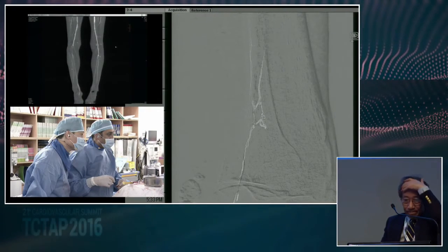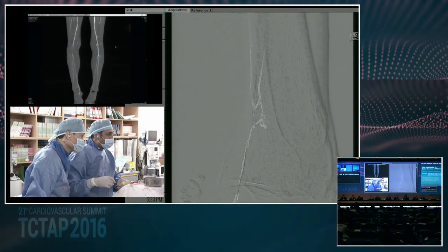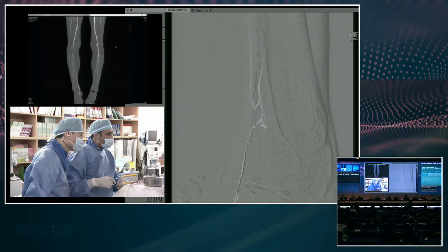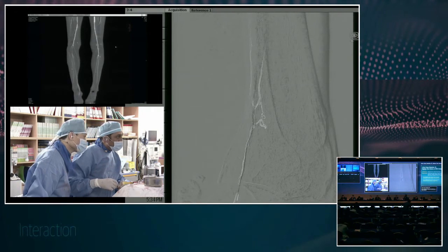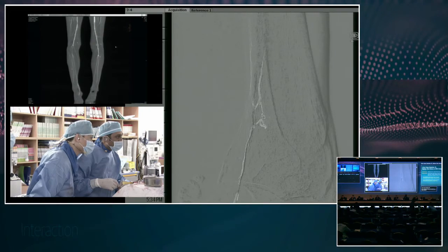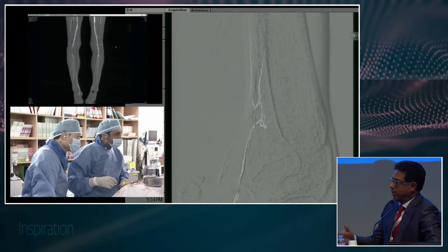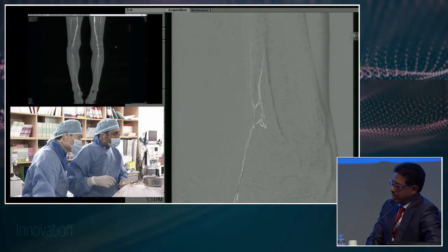So Lawrence, how do you gauge these things? You start with a 14 wire, you come up with an obstruction like this. Which way do you go? What drives you to an 018 wire like a V18, something along those lines, or sticking with an 010 system, an 014 system? Give us your algorithm for going after a lesion like this.